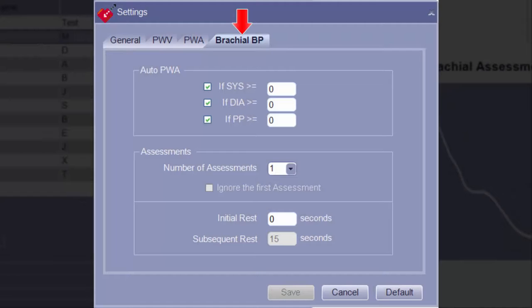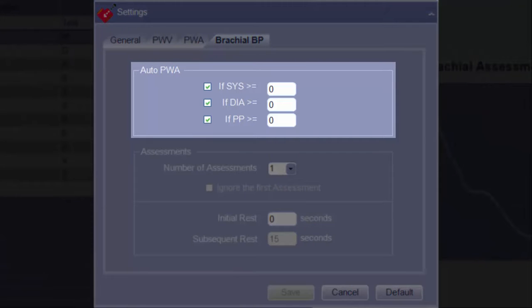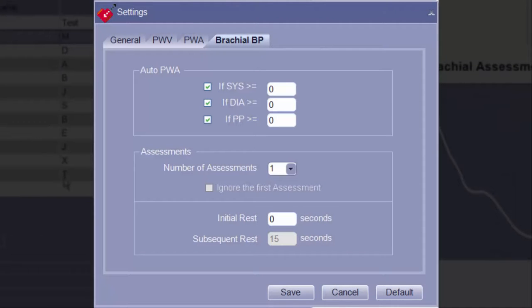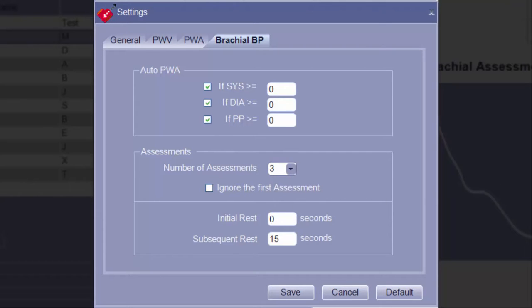The fourth tab of the Settings screen is the Brachial BP tab. This tab has settings related to brachial blood pressure measurements performed as part of a pulse wave analysis assessment. In the Auto PWA section, thresholds can be defined based off brachial blood pressure results, which would then trigger a PWA assessment to continue. Under the Assessments section, the drop-down menu can be used to select the number of brachial blood pressures automatically performed prior to the pulse wave analysis assessment. Up to five brachial blood pressures may be captured, with the software calculating the average of all blood pressures measured.